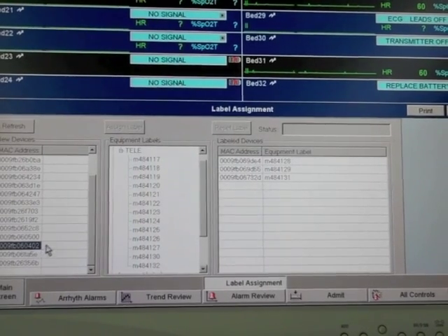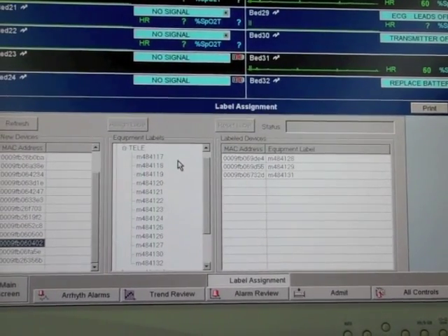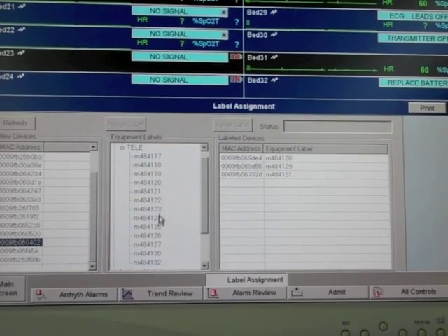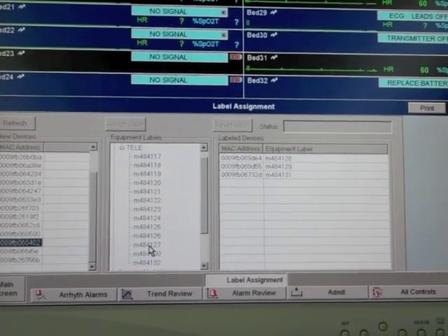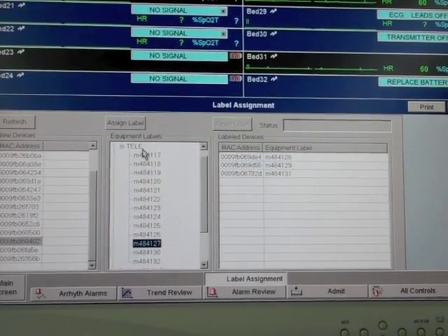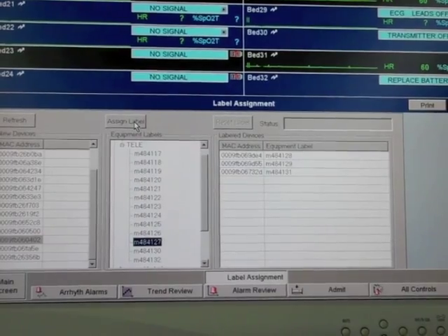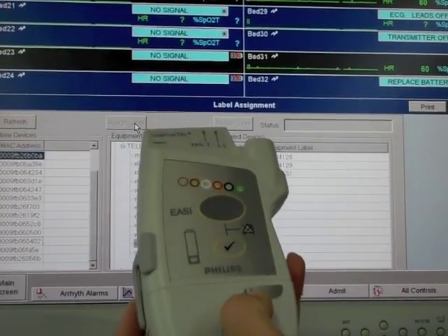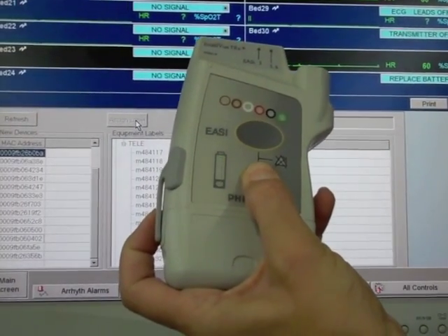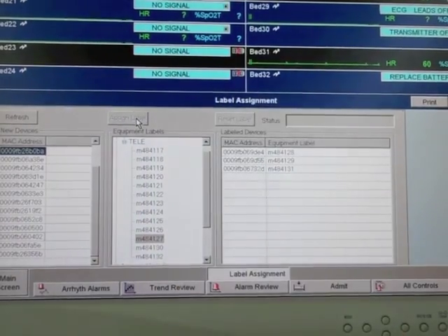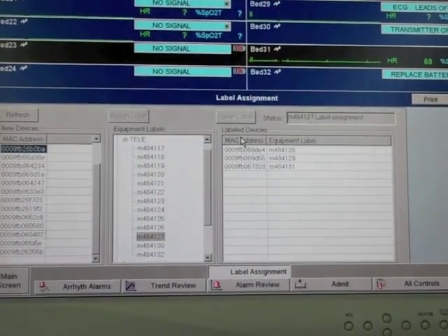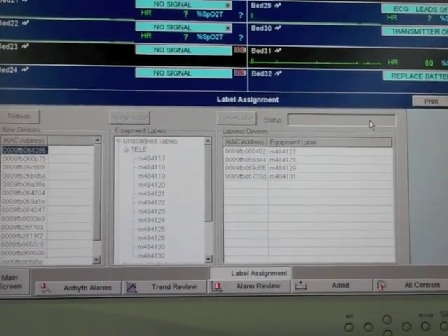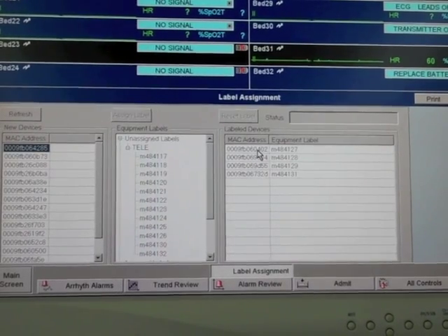You highlight your MAC address, go over to your equipment labels, select a bed for assignment, press assign label, go to your transmitter, hit the check button, and over in this column you should see label assignment pop up with the bed address.